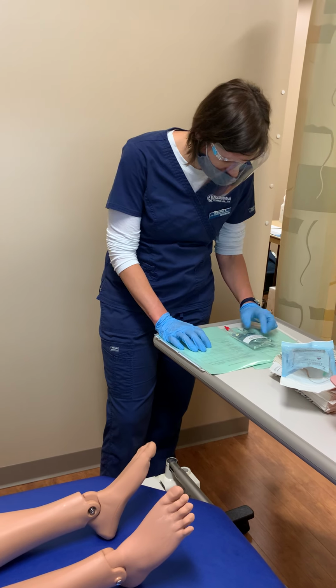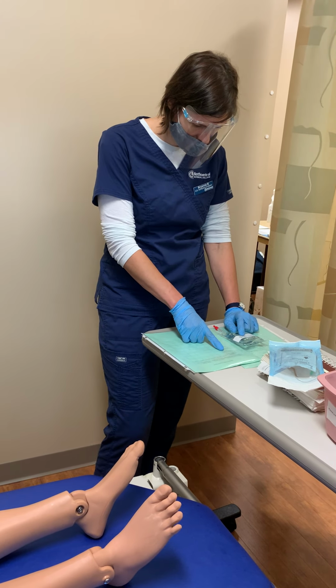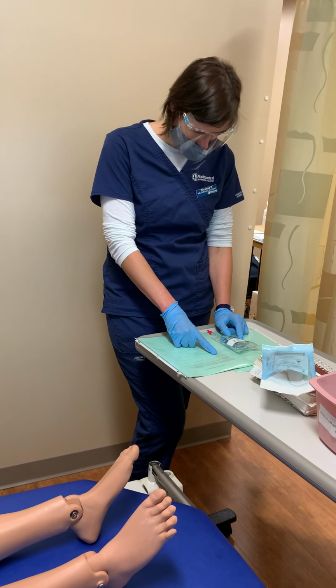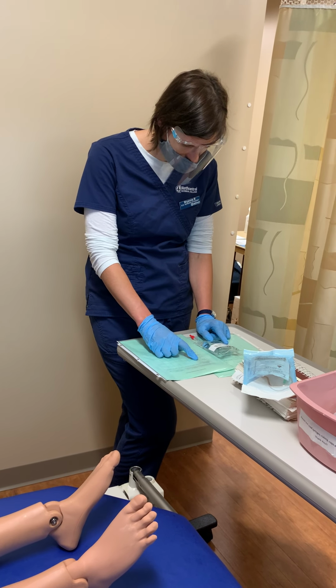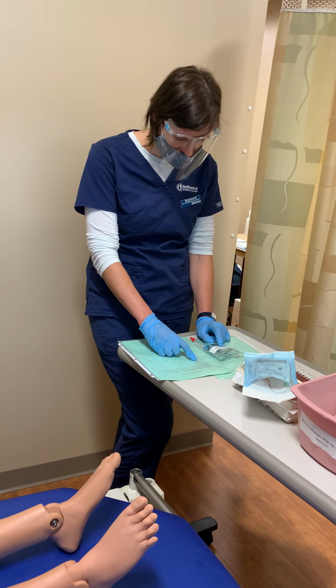She is receiving potassium chloride, 10 milliequivalents in 100 ml via IV piggyback stat. Again, I have Frances Christensen, and she is receiving her potassium chloride stat, 10 milliequivalents in 100 ml via IV piggyback.